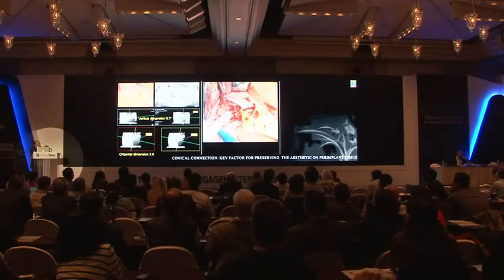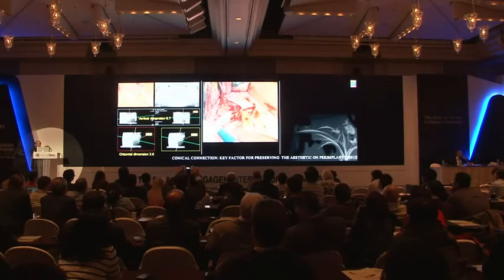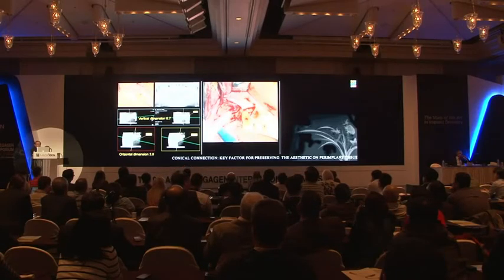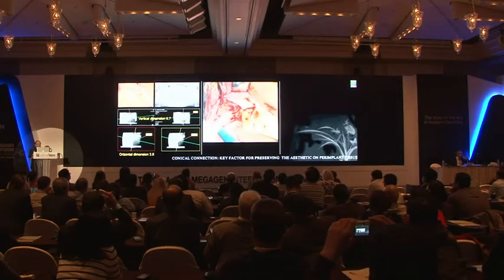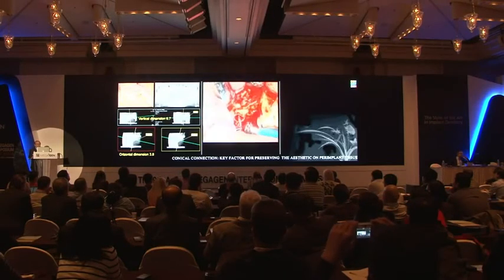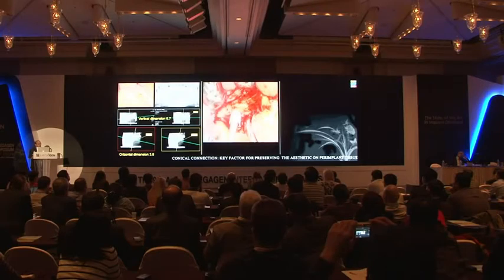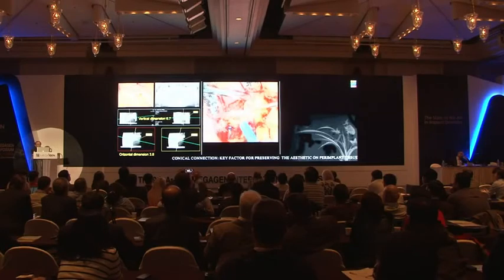In this other case, we are in the same area, but we have more bone. We can solve this case more easily, raising a mixed thickness flap, both full and partial. Full in the molar area, where we perform just a crestal sinus lift with the technique developed by my friend Samuel Lee, and placing an implant at the same time.